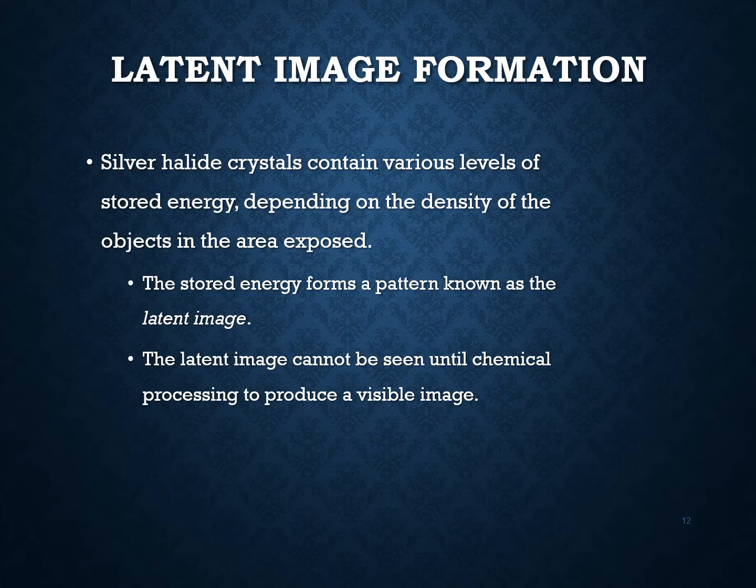Okay, so, latent image formation. Silver halide crystals contain various levels of stored energy depending on the density of the objects in the area exposed. The stored energy forms a pattern known as the latent image. The latent image cannot be seen until chemical processing produces a visible image. For instance, when the X-ray is passing through the anatomical structures, part of it is absorbed maybe by tissue or by bone, but some of those X-ray photons do pass through. That means that the receptor on the other side isn't going to get as much energy as it will in areas like in between the teeth where there's just air.